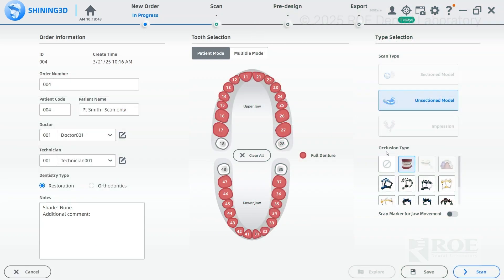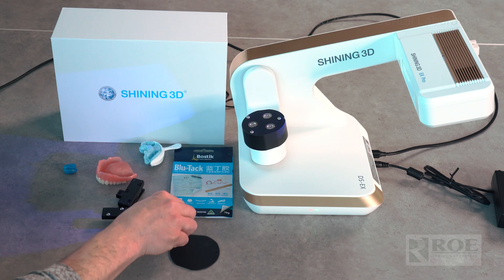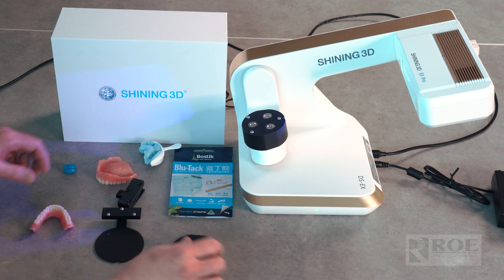In the occlusion type drop-down menu, go to 'no occlusal type,' then you're ready to scan. This will walk you through the pictures like a little roadmap. Go to lower jaw — we're going to be doing the lower denture first.